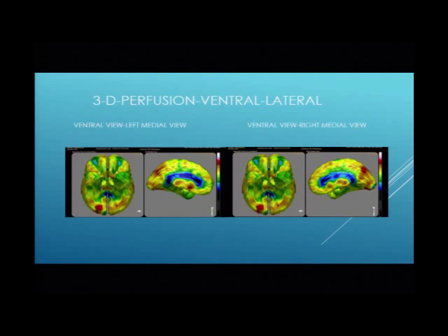And some more of these fancy views. I blew them up a little bit so you can see it better. Green is not good. Blue is even worse. And you see that left temporal lobe? Remember I kept telling you it was worse on the left? All green. A little bit of green. A little bit of yellow. A tiny little bit of brown. And it actually goes a little bit towards the back, but not quite as bad.